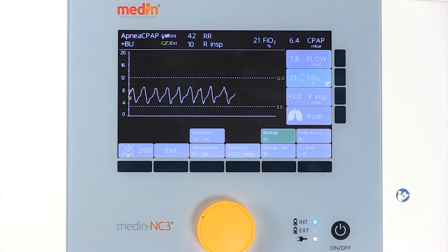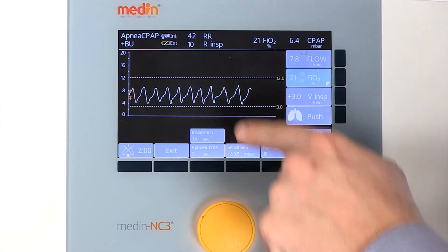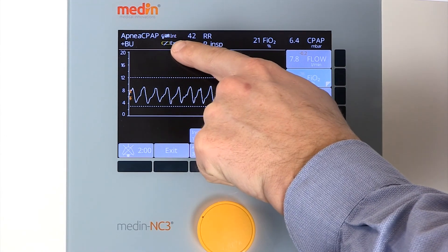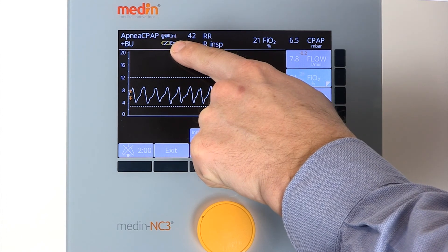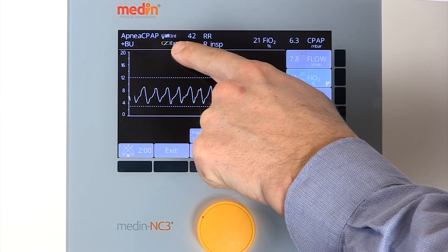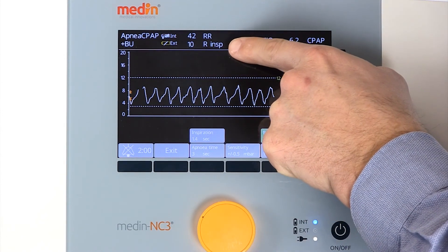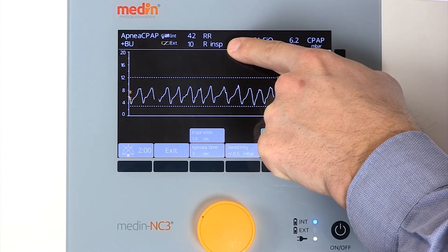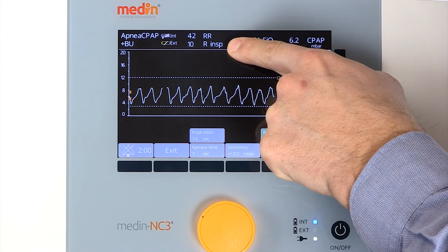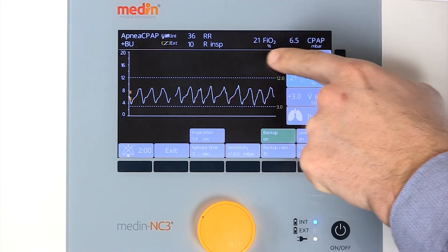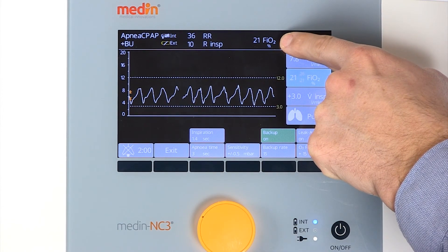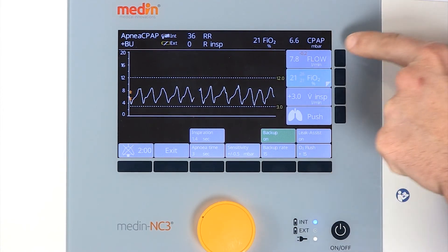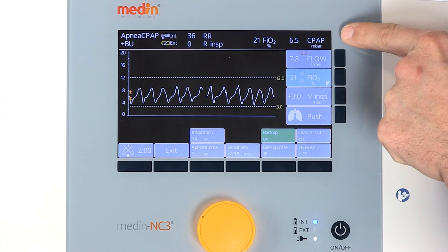The display also provides information about the battery status, respiratory rate, the number of backup breaths, FiO2, and CPAP pressure.